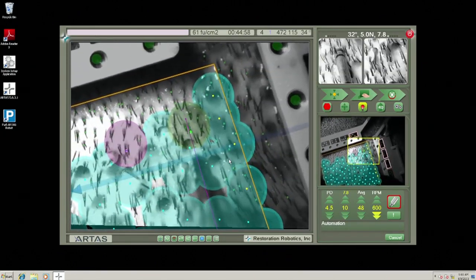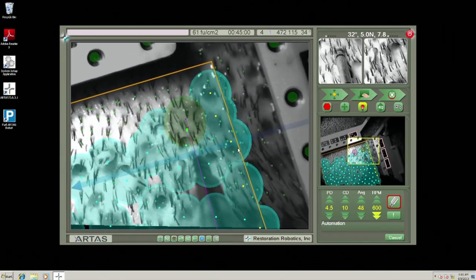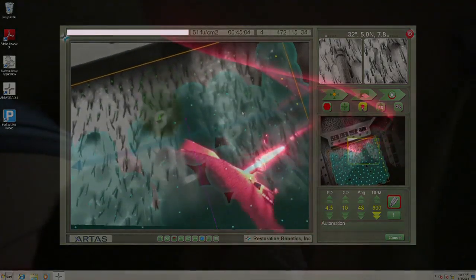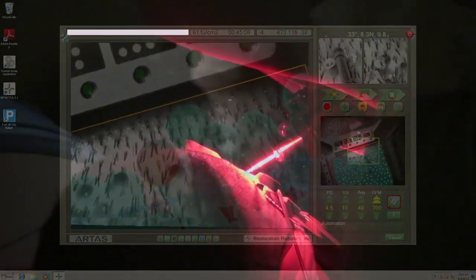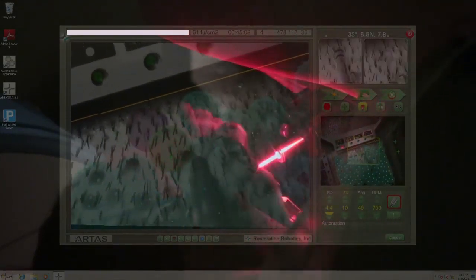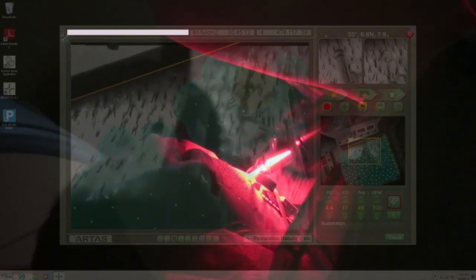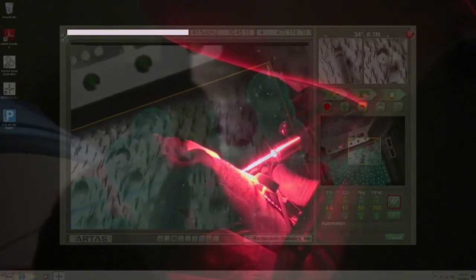Oh no, I would extract, and what we do is all of the grafts that are taken in the first hour of the case are put away in a refrigerator under hypothermosol, and their temperatures are measured by a laser thermometer at 6 degrees Celsius. We have about 8 lasers here.